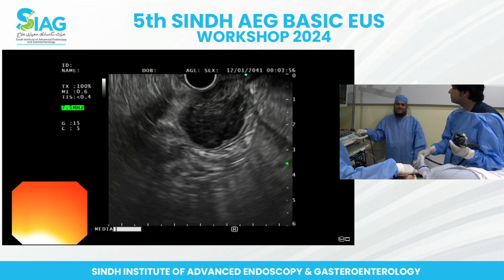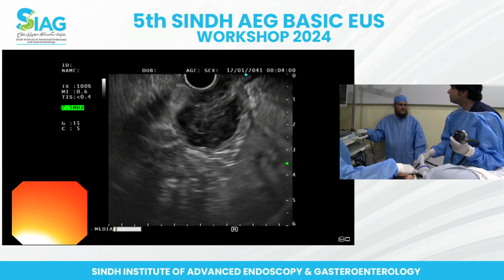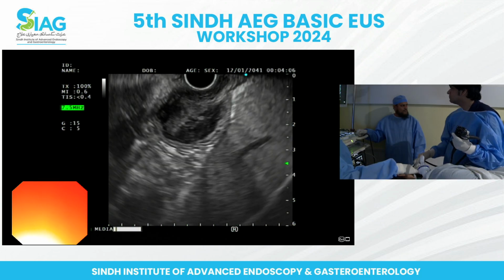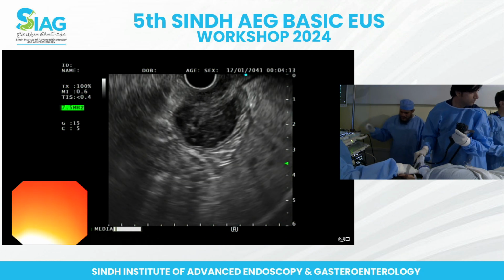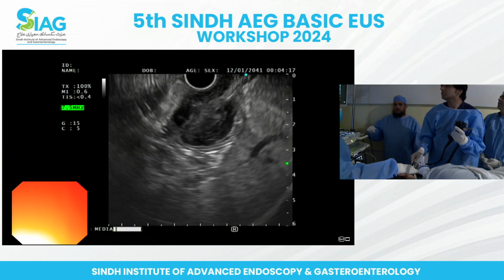I think that should be enough. Yeah, that's a good core, isn't it? Yeah, up and down. Simple. अच्छा सवाल है. We seem to have a good core, decent core this time, so probably not. Let's just not. It won't add anything. We've got cells as well, and we seem to have a core as well.